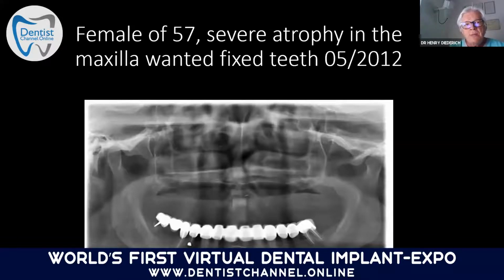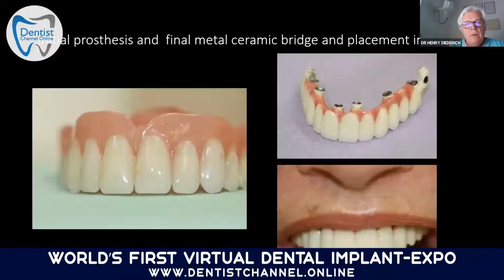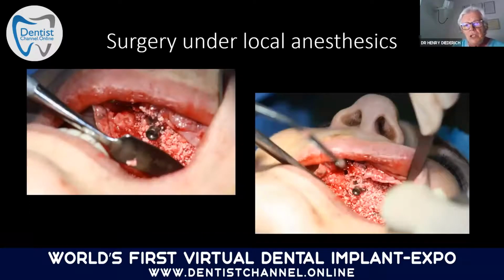So this lady, 57, came to me with a bone atrophy in the maxilla, and this case was done in 2012. So she had a total prosthesis, you see on the left side, with this insertion, and then the final result was a metal ceramic bridge and the placement in the mouth. And that was done in a very short time. In general, we finish our work in 10 to 12 days. Surgery was done under local anesthetics, so I do all my surgery under local anesthetics.